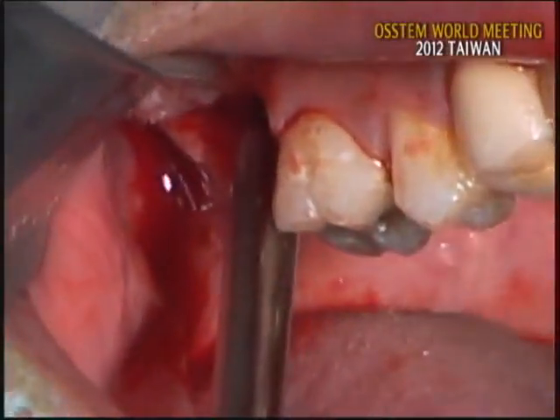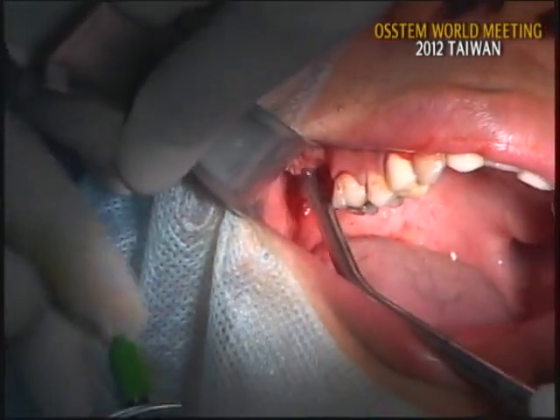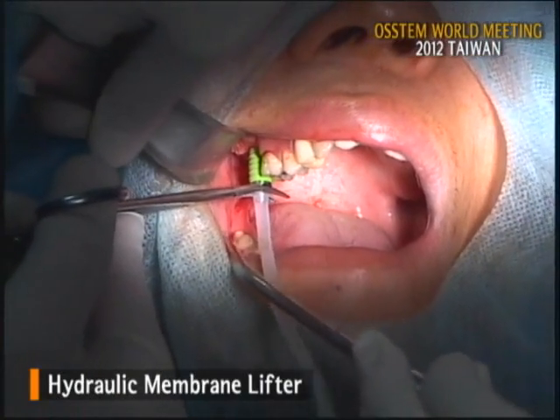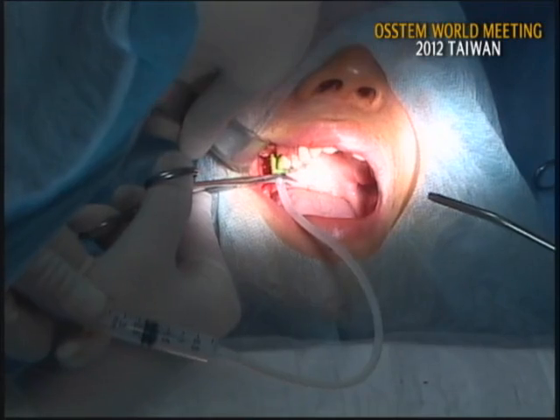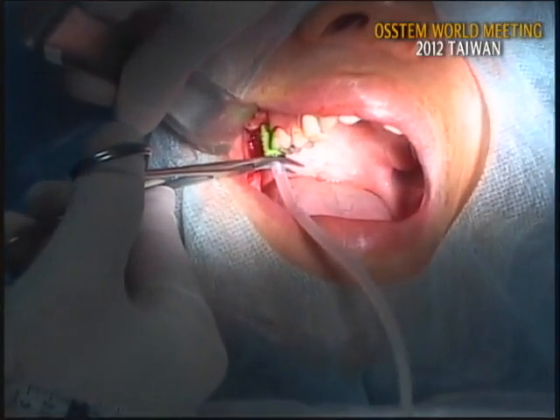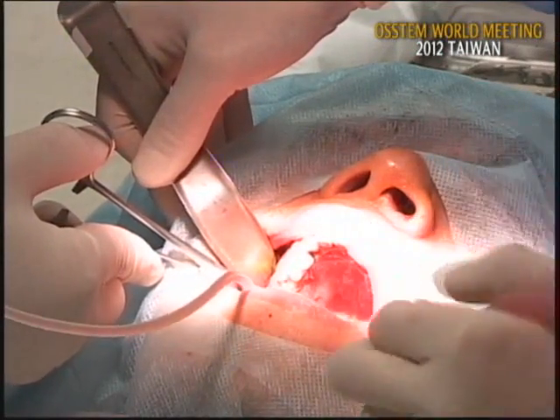Here I prepared 2.0 cc normal saline with the membrane lift system. Hold the membrane lifter with the mosquito and seal the hole with firm pressure. Then inject 0.5 cc of saline slowly and pull out. You can see the successful membrane detachment. The color of the solution is changing reddish. It means that the membrane successfully detached without perforation.